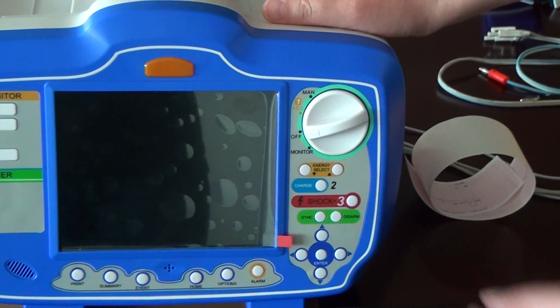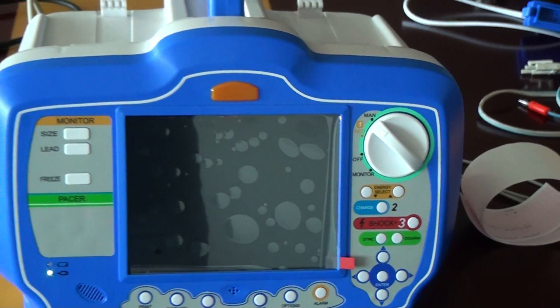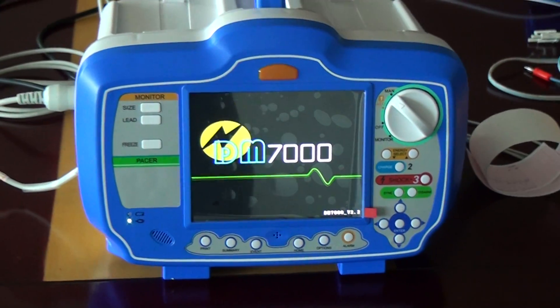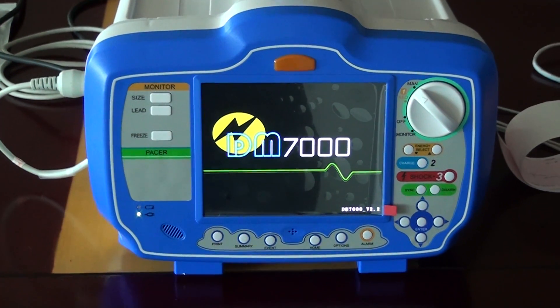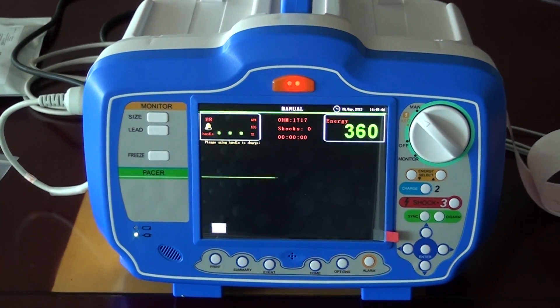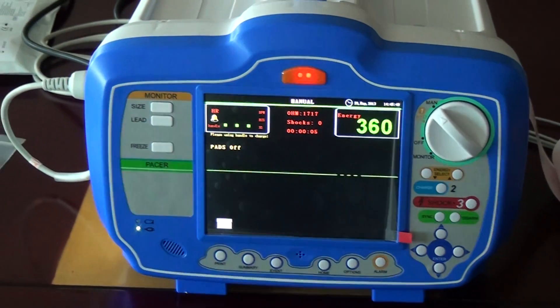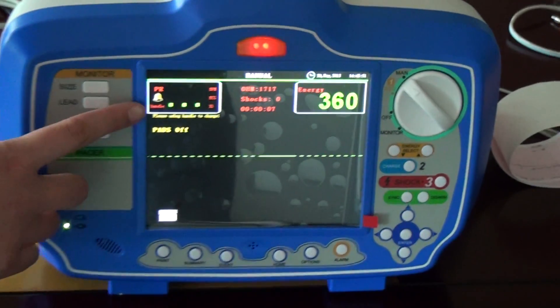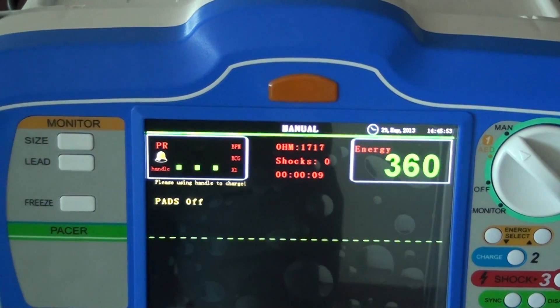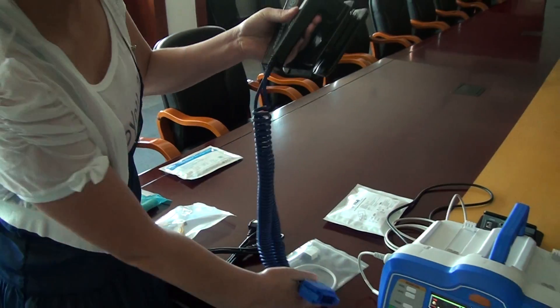For more information, please read our user manual. This is for the monitor mode. Now we turn off and enter the menu. It will show the handles, so we need to use our handles.